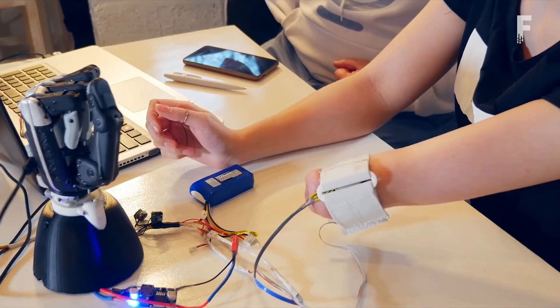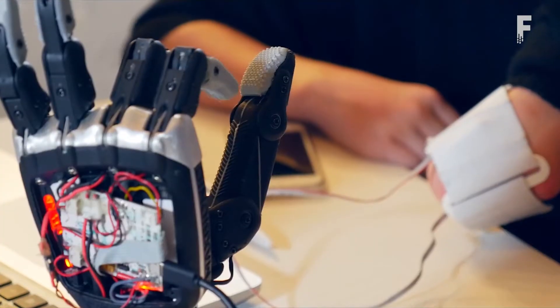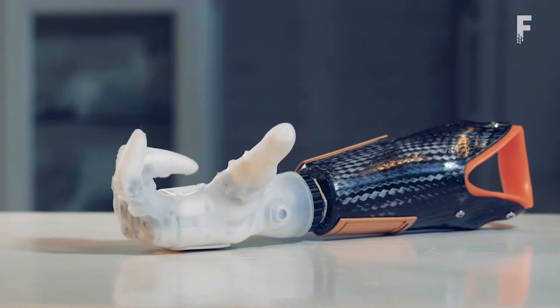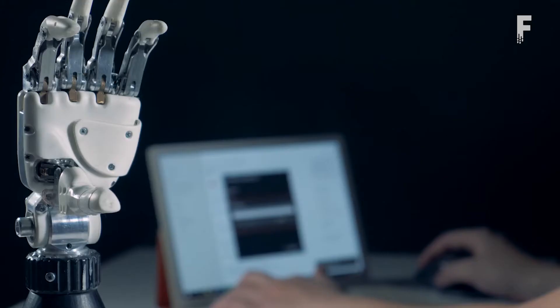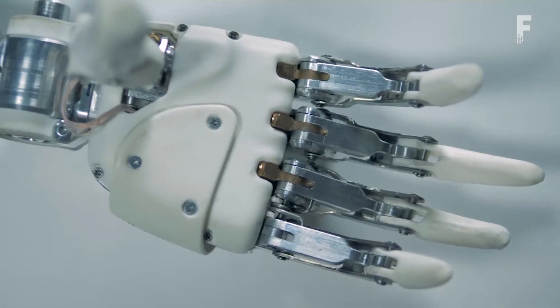Each finger of the prosthesis works independently of the others during the capture of an object. If the shape of the object is complex or small, the prosthesis will clasp the object with all five fingers with a secure hold. The system significantly increases functionality and allows the prosthesis to clasp objects like a living hand.